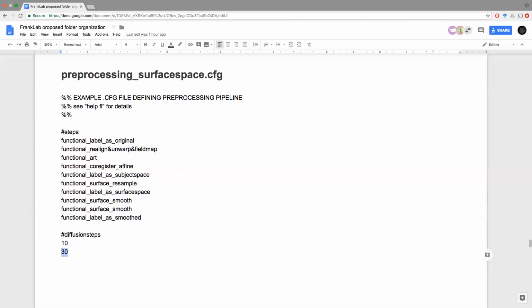I don't recall exactly, but the typical scenario is, if you were lacking power, I would typically recommend using the fully smooth data. If you had data that didn't quite reach the parametric or non-parametric threshold, I would probably say use the fully smooth data because that's going to give you higher sensitivity.